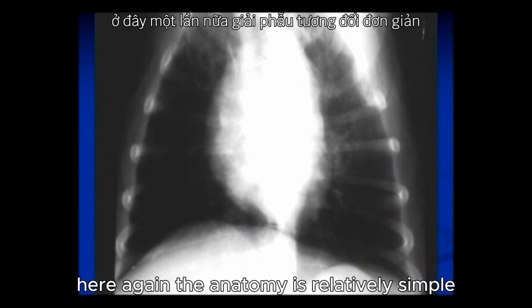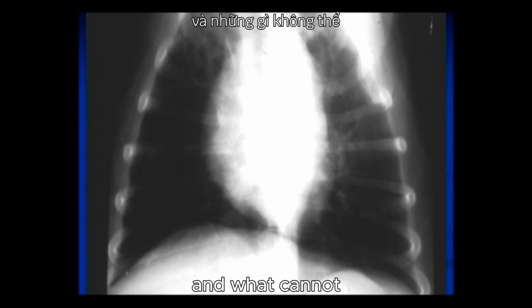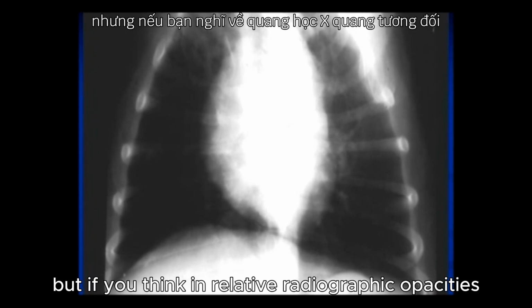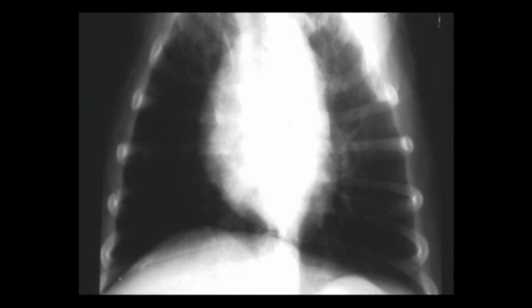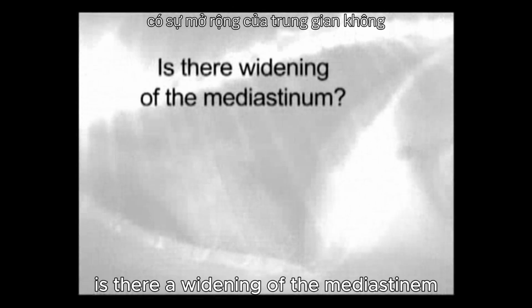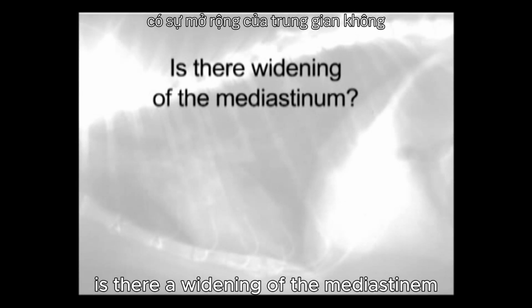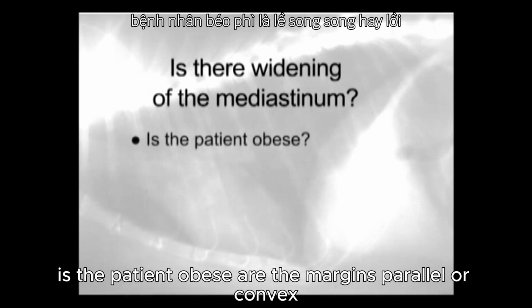Here again, the anatomy is relatively simple. The only difficulty is in determining what can be seen and what cannot. But if you think in relative radiographic opacities, you should not have too many difficulties. Next, ask yourself the following questions. Is there a widening of the mediastinum? If the answer to this question is yes, is the patient obese?